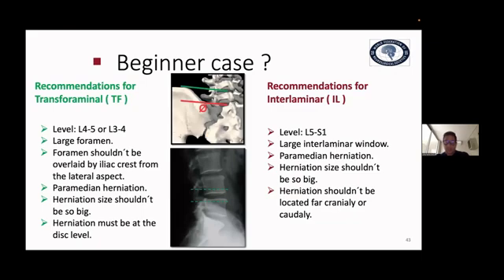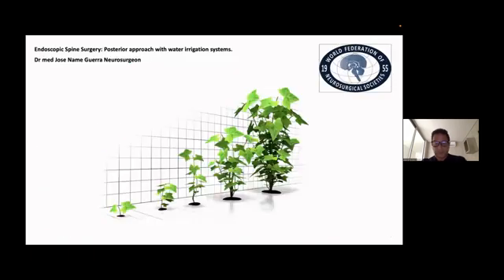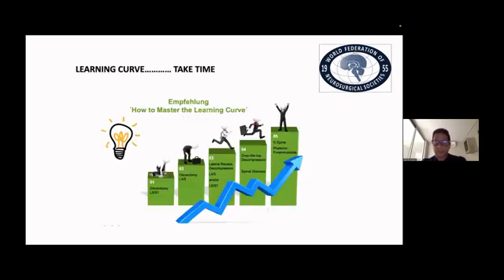I always recommend starting with easy cases, not only with the transforaminal approaches, but also with interlaminar approaches. It doesn't matter if you are an experienced surgeon, you should respect the learning curve in endoscopic spine surgery in order to avoid complications. The learning curve will take time, but once you grow with the technique, you will be able to perform the same surgeries that you do in an open way using an endoscope. Take your time to increase the level of difficulty of the surgery.